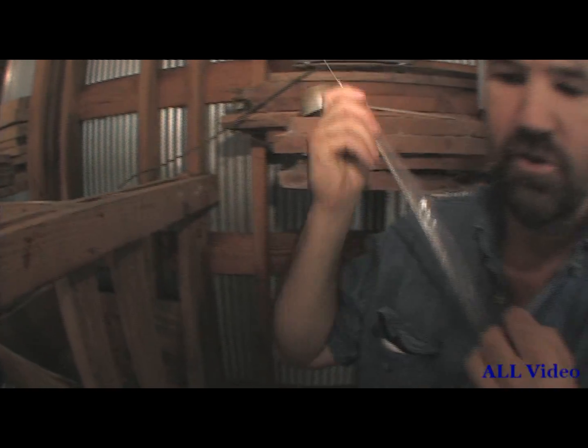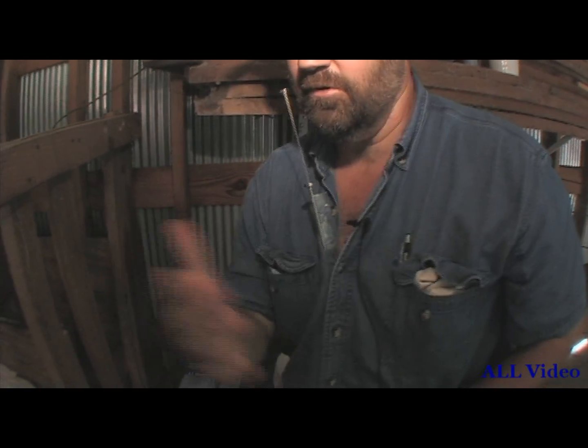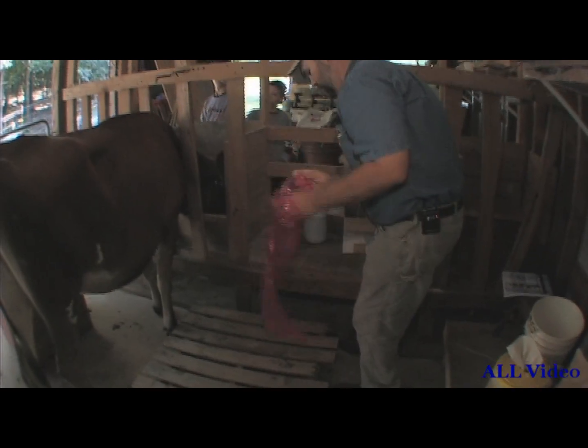Leave the bag on. Put it inside your shirt, next to your body temperature. Okay Steve, you'll need to move back. We'll put a glove on and lubricant. We're a go.